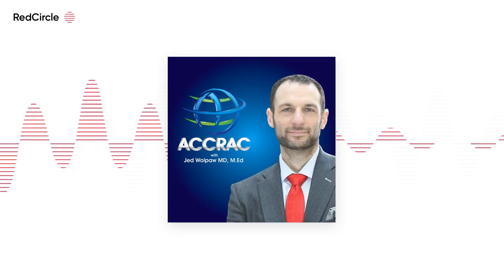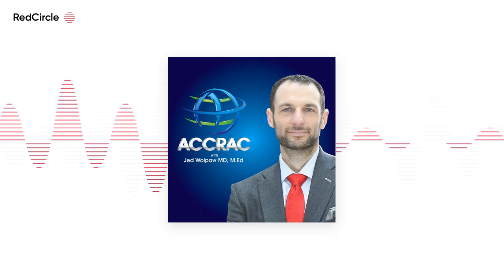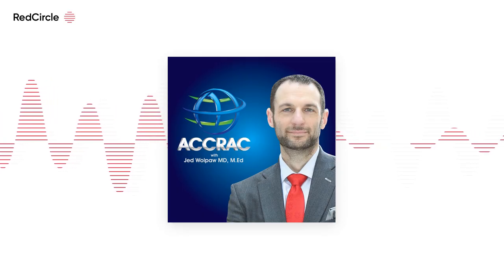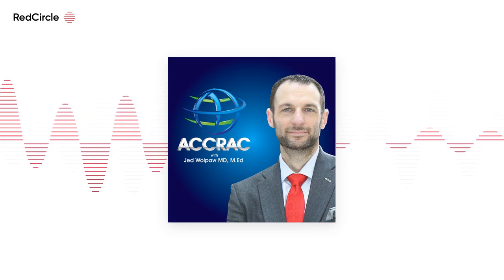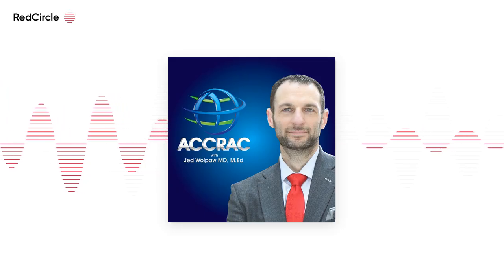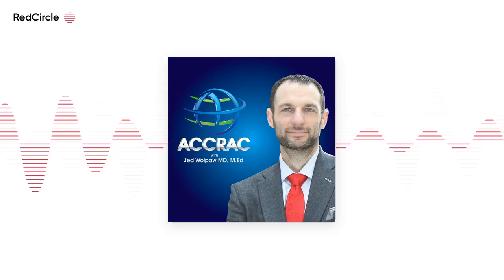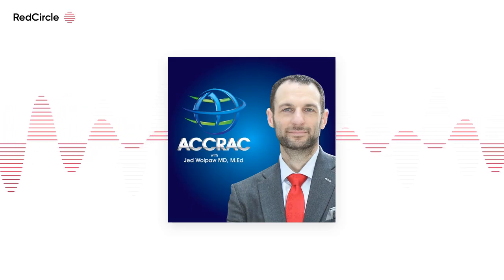You could argue, okay, I'm in a linear part here, maybe I'll just go to the lowest one where it's the same. And then if it goes up or down, as I mentioned earlier, sometimes the compliance going up could mean that you have more collapse in tidal recruitment. It gets kind of confusing because now you're sacrificing a little less overdistension, but now you have the tidal recruitment. So the question is, is a little more overdistension okay with a little less atelectrauma, or what?